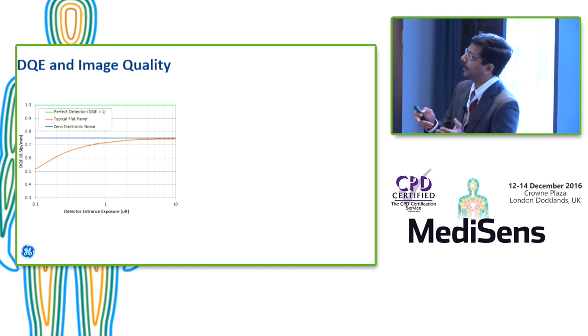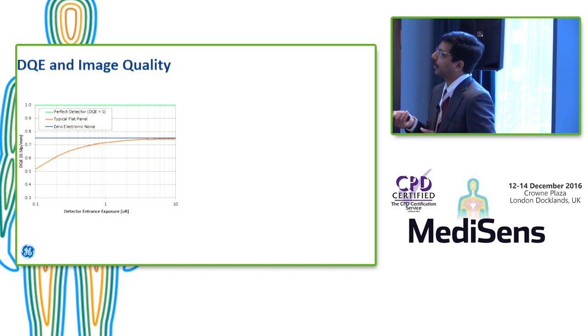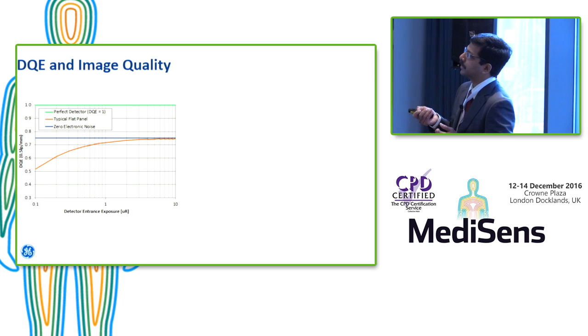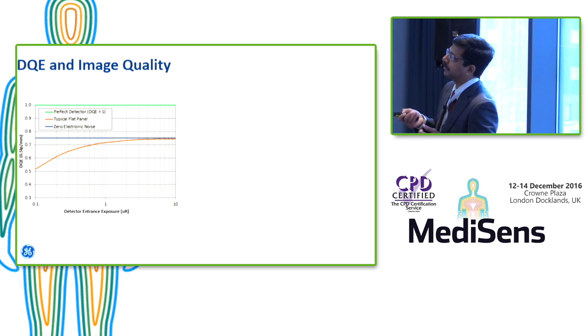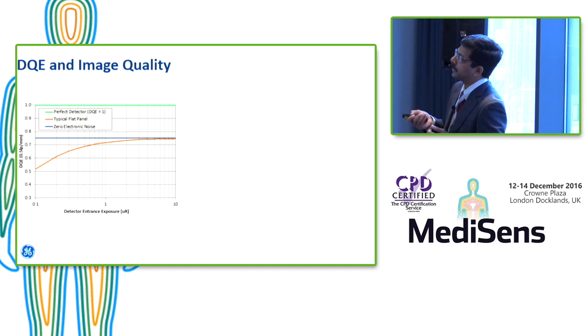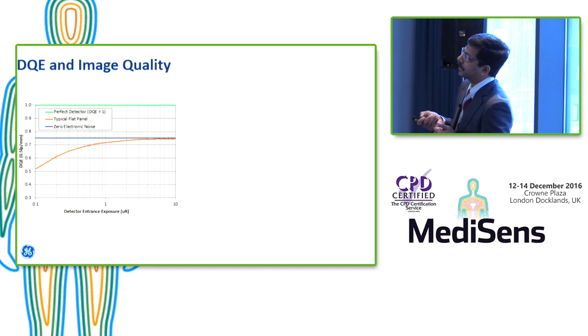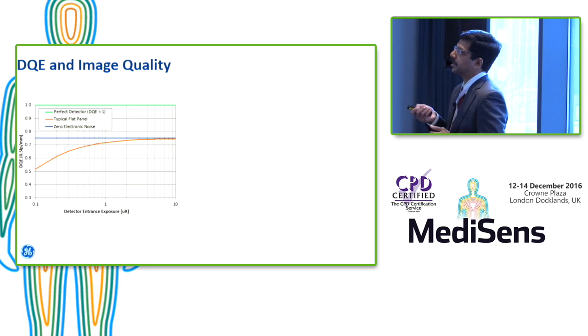Now, again, the relation between DQE and image quality. So here, again for illustration, we have a plot of DQE as a function of exposure. And again, the ideal, perfect detector is where the DQE is equal to 1. A realistic detector is, as I mentioned, about 80% or 75% DQE at a high dose. And from there, if you go down in the exposure, you can see that I'm plotting two different cases here. One is for a typical flat panel. You can see that the DQE drops. And the other is when we have a panel with zero electronic noise. It's perfectly flat.